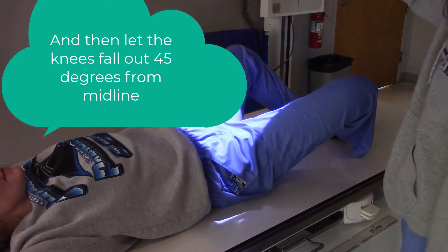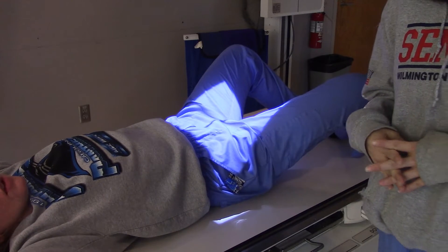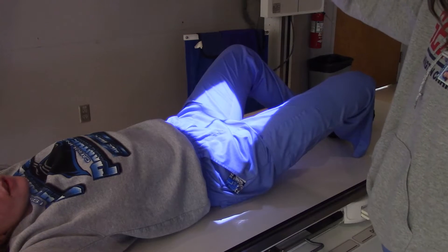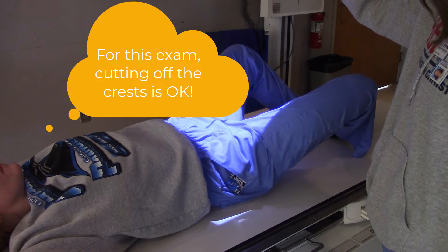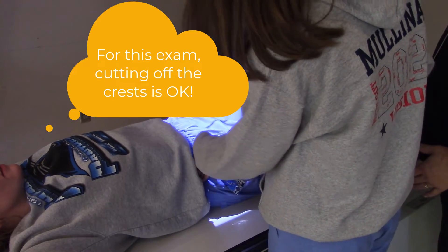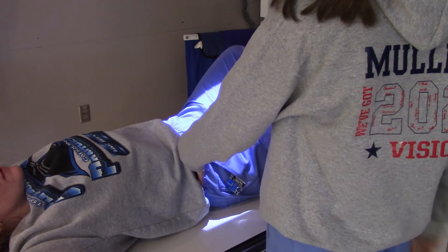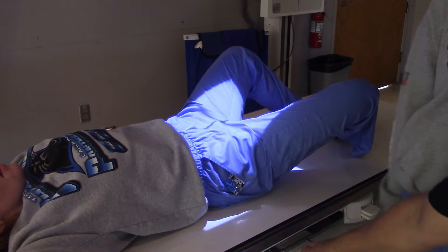Are we going to include her crest on this? Well, if you're going three inches below the ASIS, isn't it going to cut it off a little bit? Possibly. The picture shows a little bit of crest. Right there? Well, that's as far as it didn't go. I barely got it.